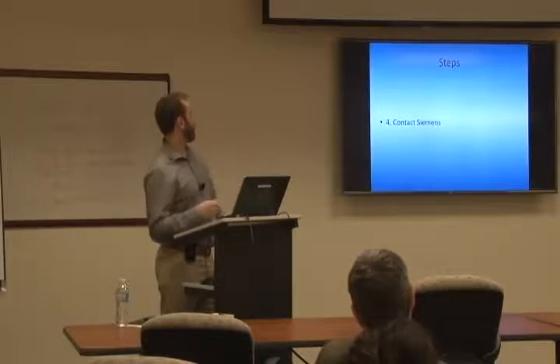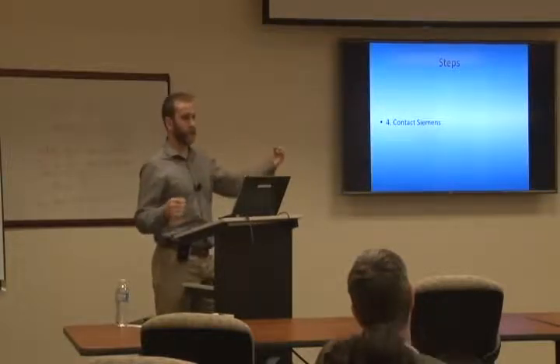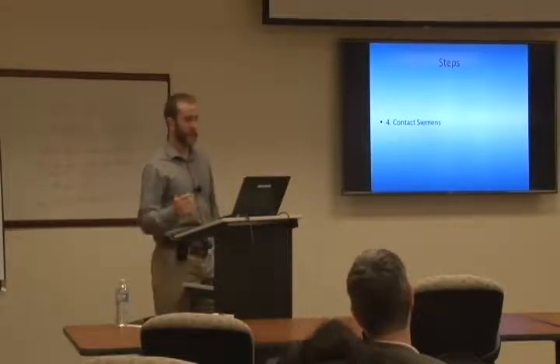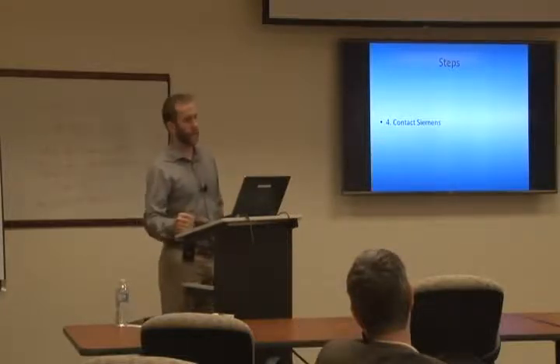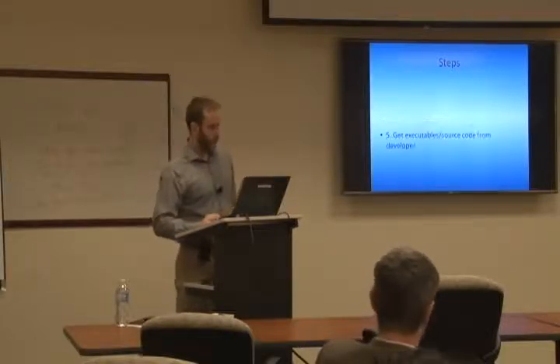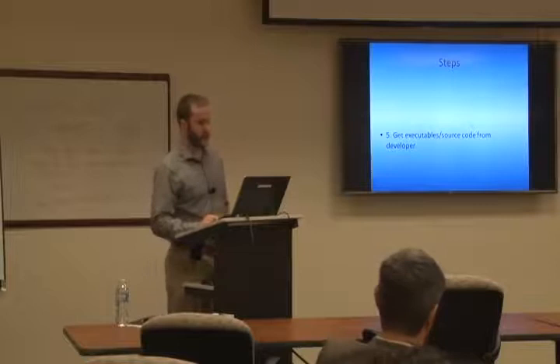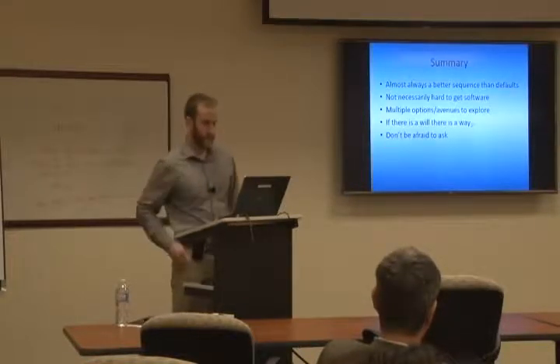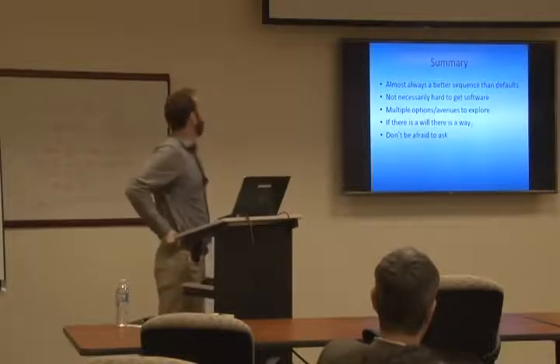So this would be something that you would contact Jerry about. You would say, hey, you know what, we want to do a C2P with this site, and he would take care of it for you. Sign some papers, and that's that. And then they give you the source code, put it on the scanner, and that's it. So yeah, that's pretty much how you bring the sequence on there.